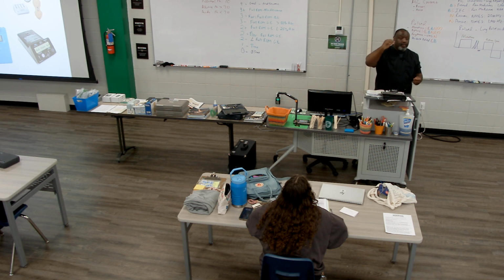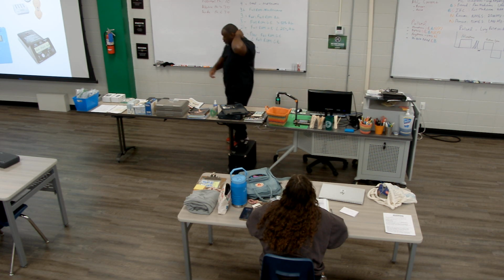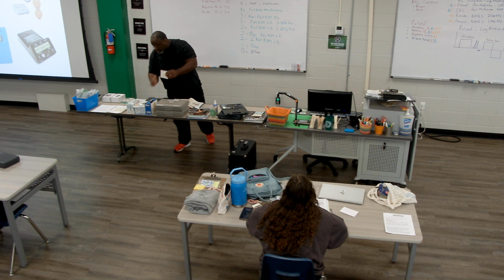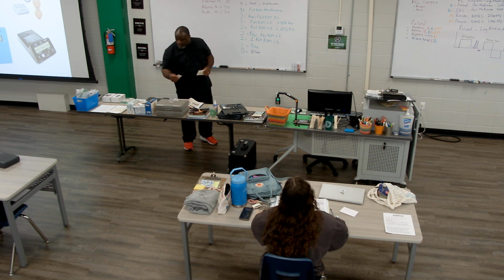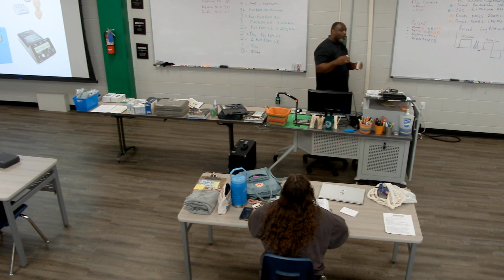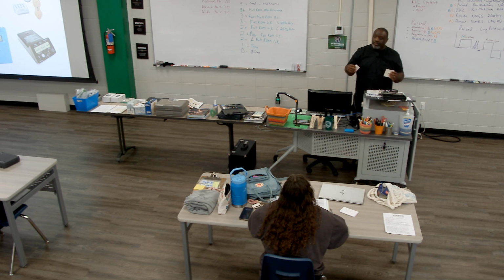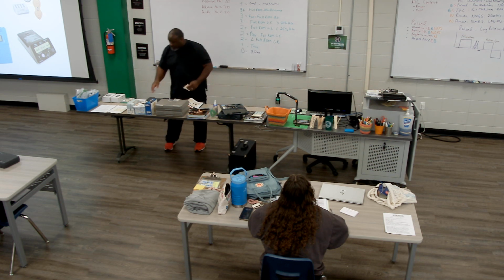It does have a pin that's very similar to what we've used, but instead of it having pins here, it has clips, and the clips will click onto these electrodes that look like this. So it's a treatment electrode and a dispersive electrode. The clips will clip on here, and that's how current is introduced into the body using these iontophoresis pads, or these iontophoresis electrodes.